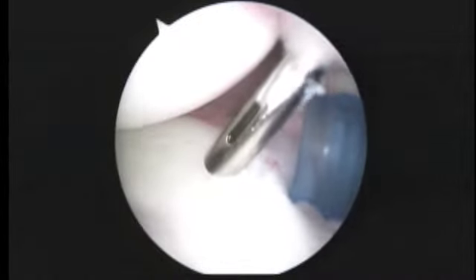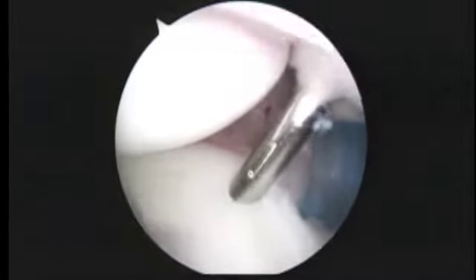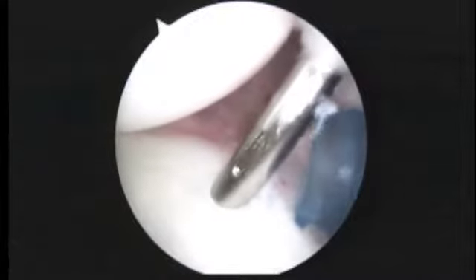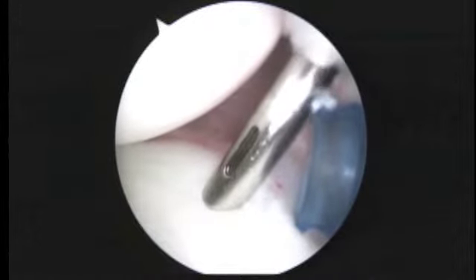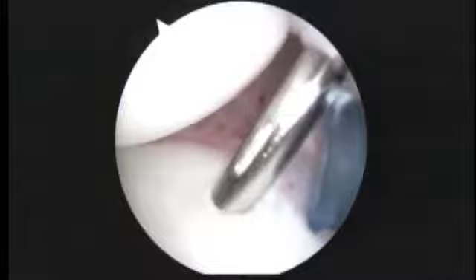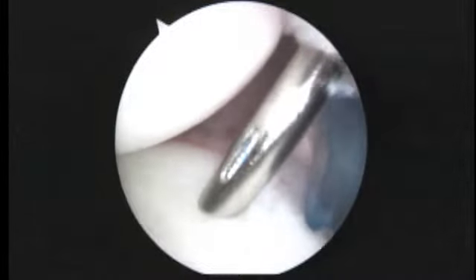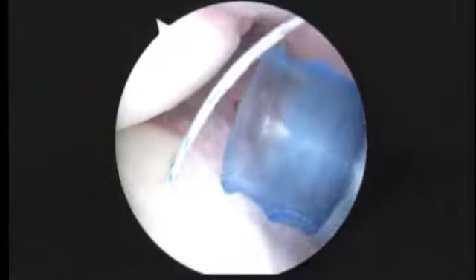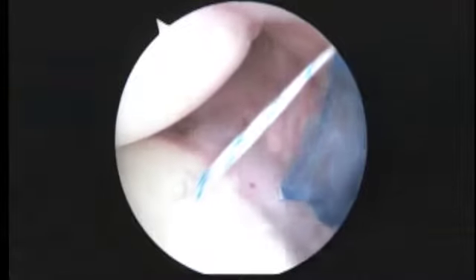So we'll take the drill. And we'll go right down into the bone. And then after the drill, we'll place our suture anchor down. And we'll tap it down with the mallet. So next we unload the inserter. We'll pull back on the suture anchor to seat it, just like that. Feels pretty solid. And next we'll take out one suture. Take it out here.